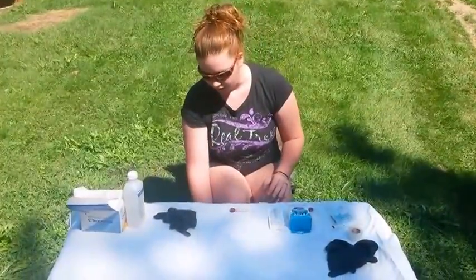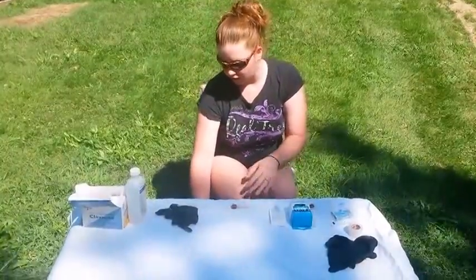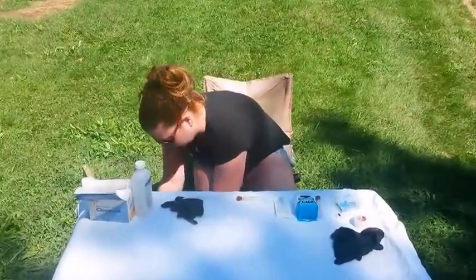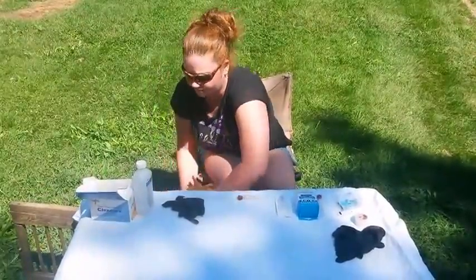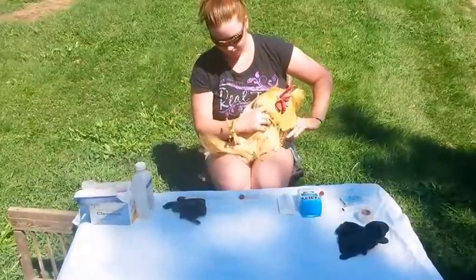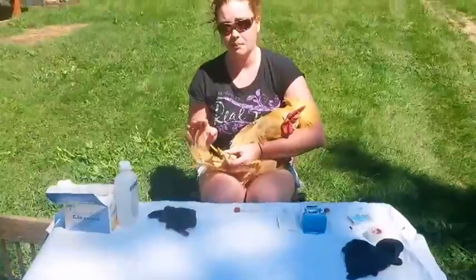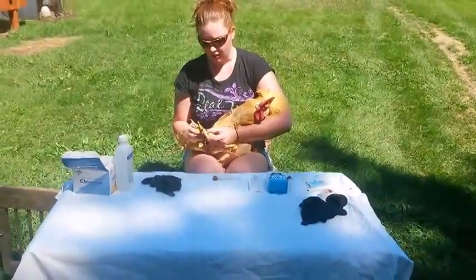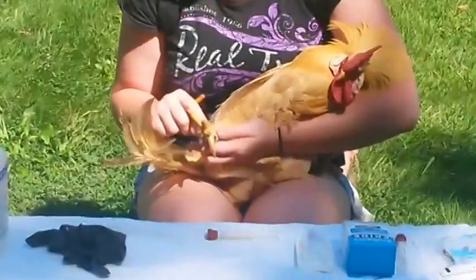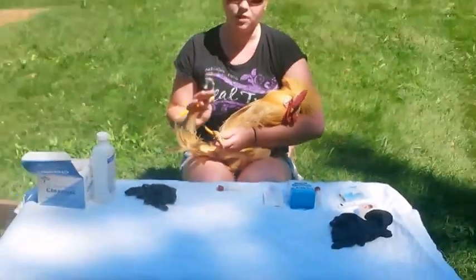So what I'll do — I'm going to be using as my test subject Tornado, the buff leghorn Brewster. He's a little upset that he's in the show cage. What I'll do, so that if anything does ever come back, we talked to the state vet and he said this would be the easiest way to tell: you take their leg band numbers because you're already enrolled in NPIP. Use these leg bands to your advantage.